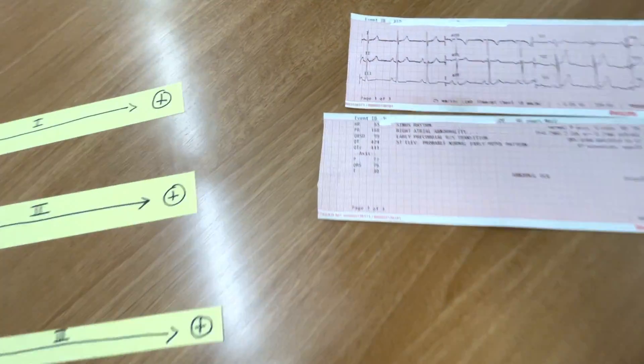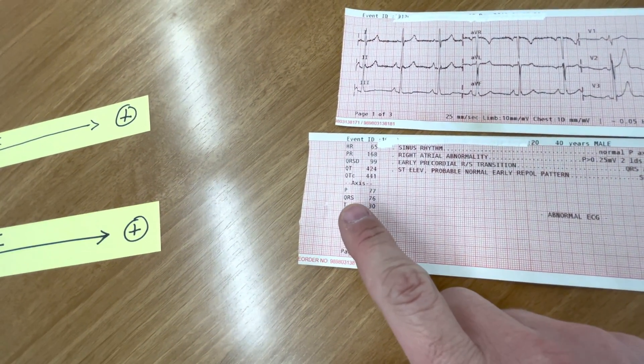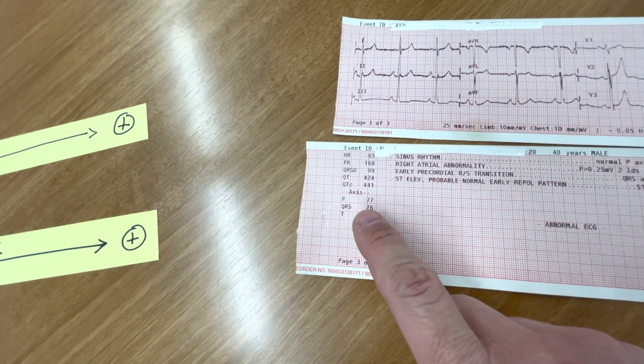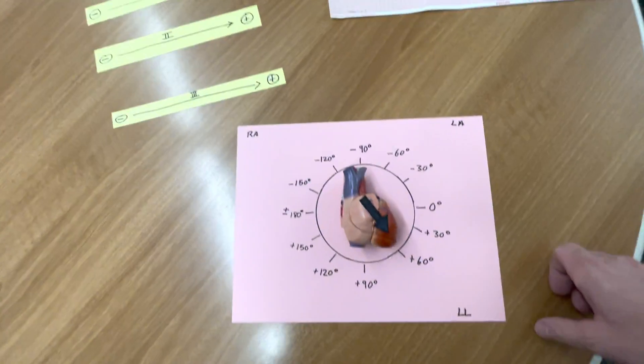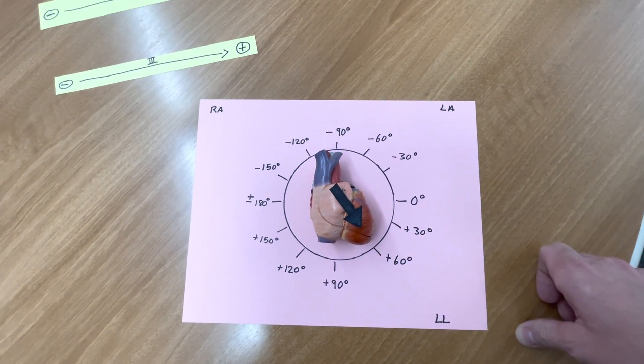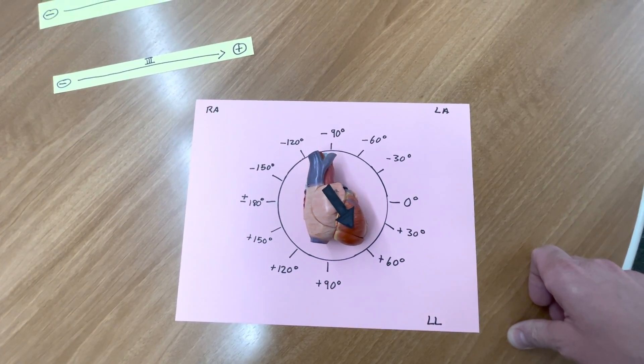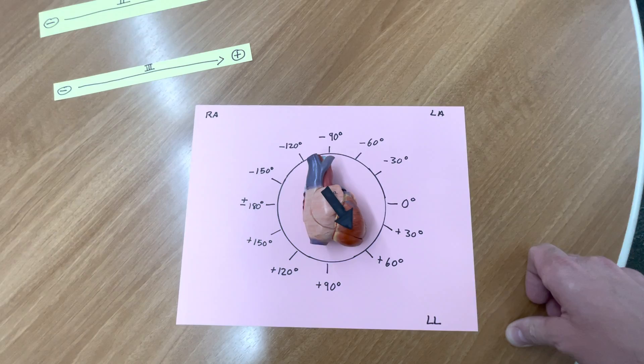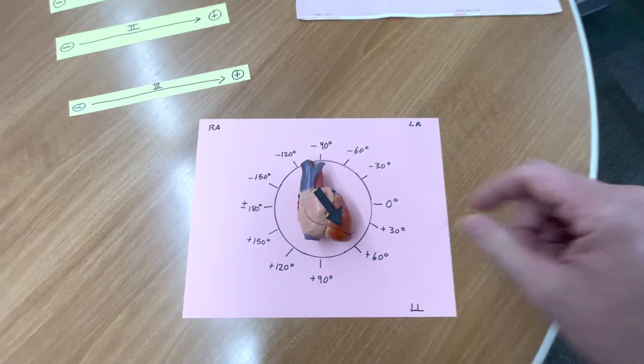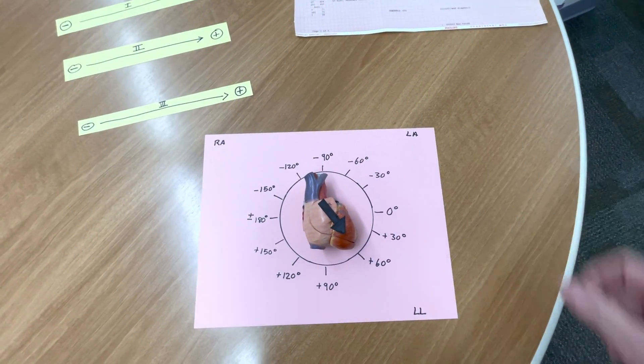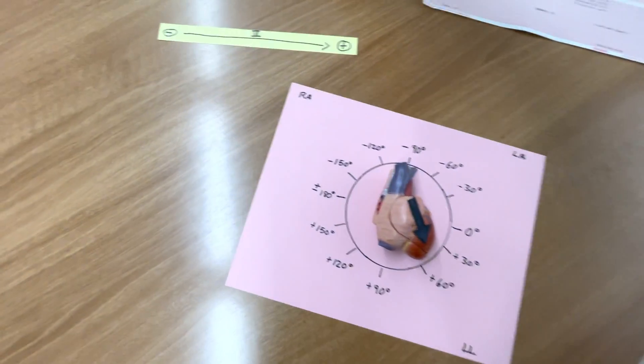Specifically, what we're talking about is the QRS axis or the Q-axis. That little number right there, 75 in this case. That is what normal axis is. And the way that we can conceptualize this further is by looking at the limb leads.